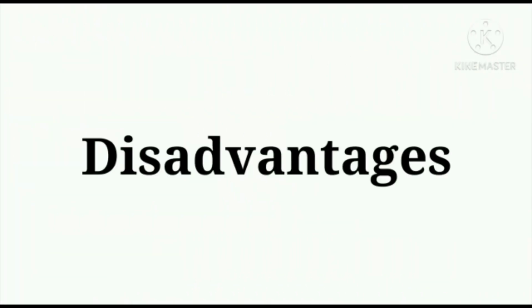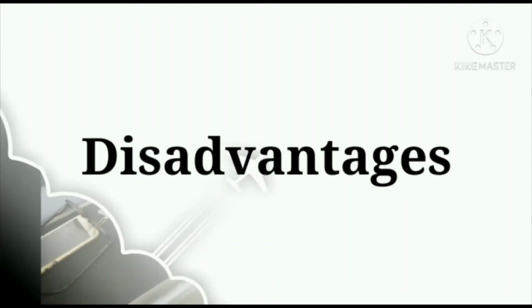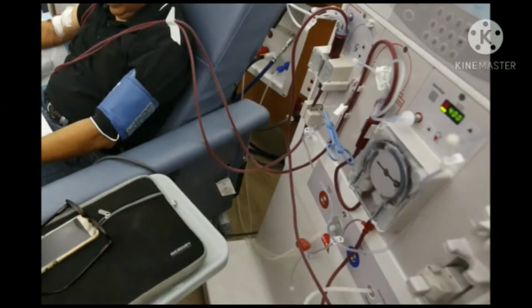On the other hand, it also has its own disadvantages. First, you must travel to a dialysis center, which may be required 3 times a week. Second, patients may not be able to set their own treatment schedule. Third, permanent access is usually required in the arm for adults and the neck or chest area for children. Fourth, needles are required to access the fistula.